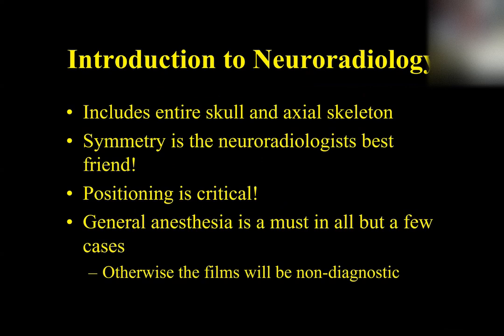The other thing that I'll tell you, and I'm sure Dr. Warner told you the same thing, when you're shooting radiographs. Oh, here's another question for you. What's the difference between a radiograph and an X-ray? Anybody know that? Well, a radiograph is the real word for the picture you look at on a computer monitor, or in the old days, you would hold the piece of film in your hand. That's the picture. That's the radiograph. The X-rays are invisible and they pass through the patient.